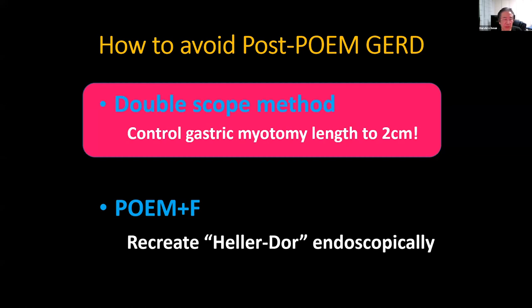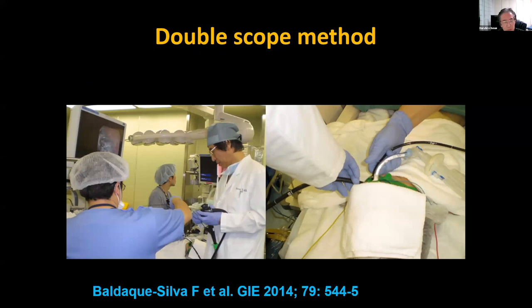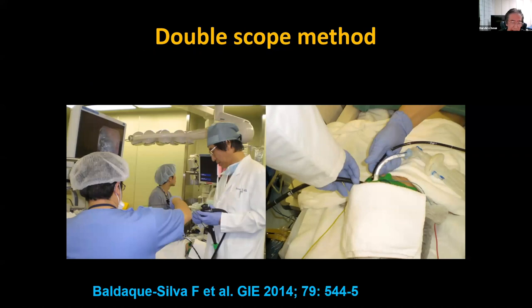One recommendation — the most reliable one — is the double scope method to control the gastric myotomy length. We place two scopes through the patient's esophagus: one scope is in the submucosal tunnel and the other is intragastric in the retroflex position. The mother scope in the submucosal tunnel performs the myotomy, and the baby scope in the stomach controls the gastric myotomy length to one to two centimeters. This is the same as the surgical principle.